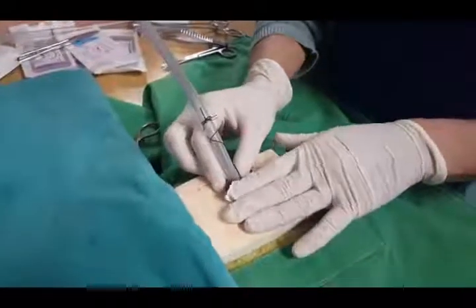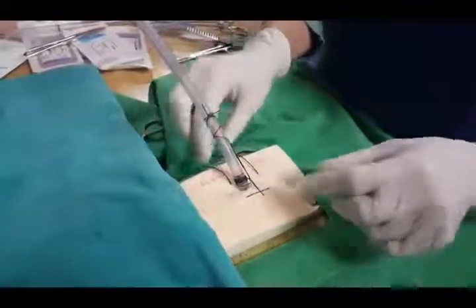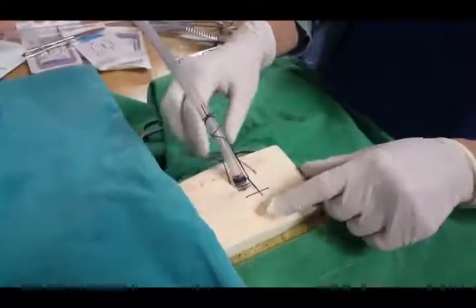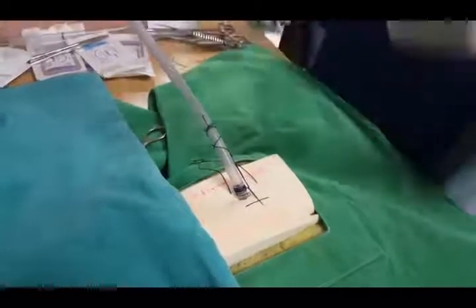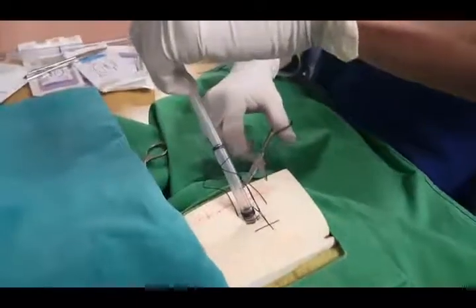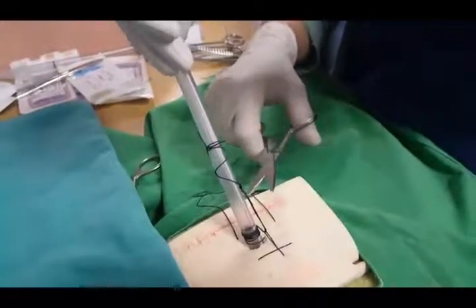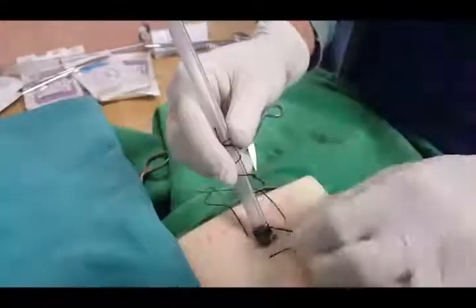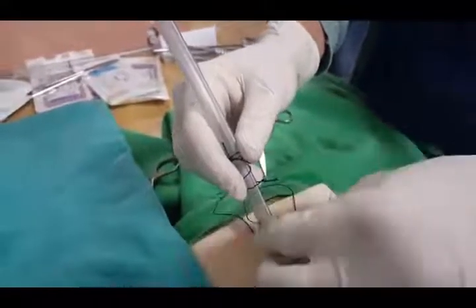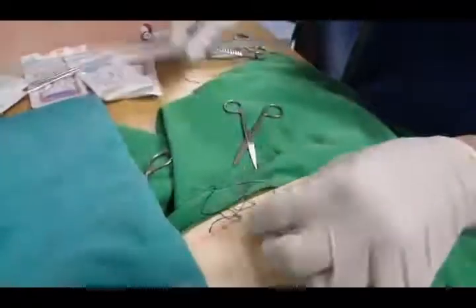Until the tube's ready to come out. When the tube's ready to come out you obviously ask your patient to do a Valsalva, either on the end of inspiration or expiration. You will cut over here — you can see that original knot — you cut over here, undo the sides, and at end of inspiration or expiration pull the tube out.